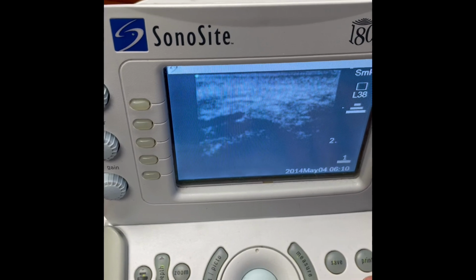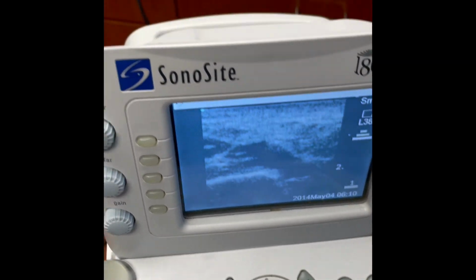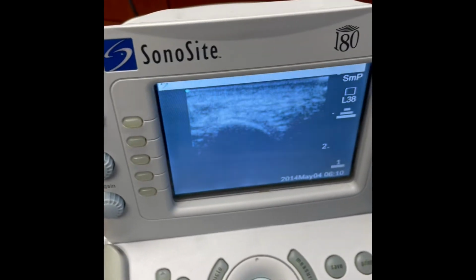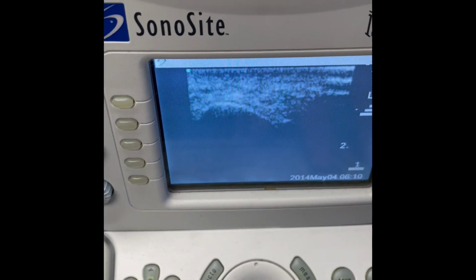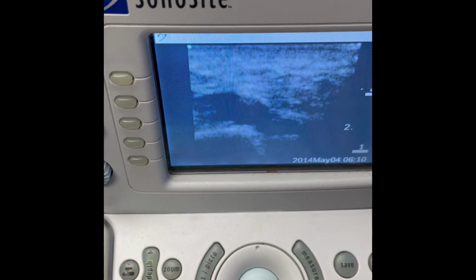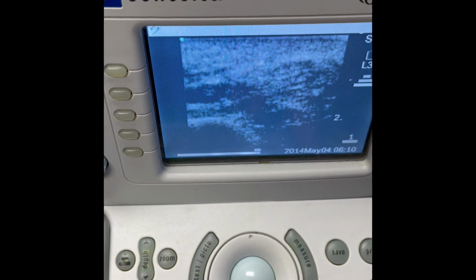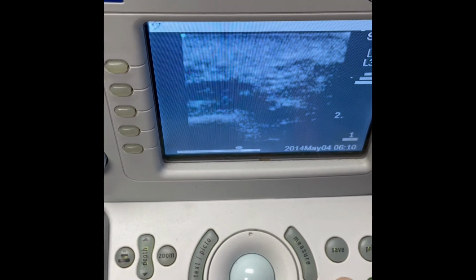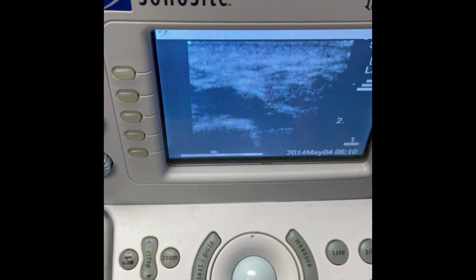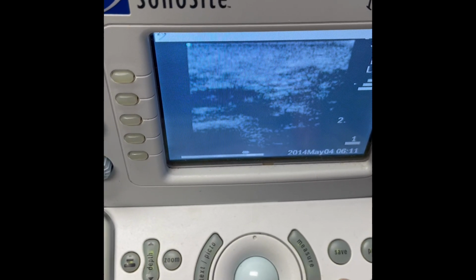So like start somewhere. Okay, so start back there. Okay, so now we're in a different location. So she'll go back and forth. So start distally, or yeah. So we should be able to be recording this whole thing right now. Okay, and that stops it. So then we go backwards. Hit the save button first when you freeze it. Yep. So as you can see, it's showing us our recent images.